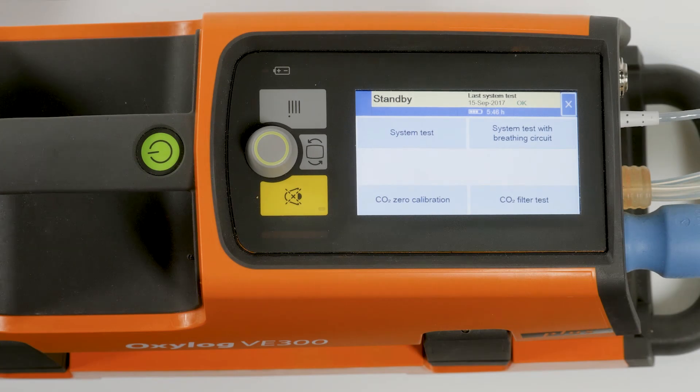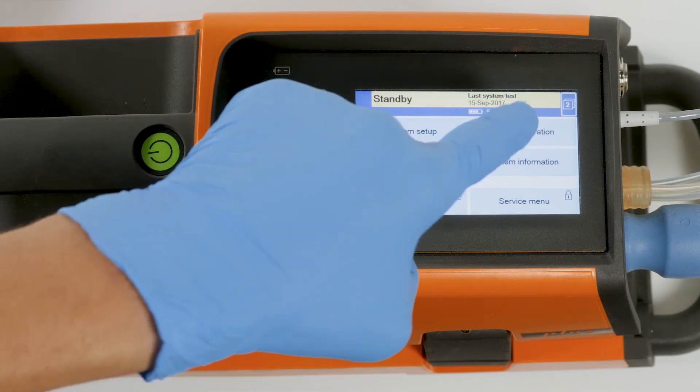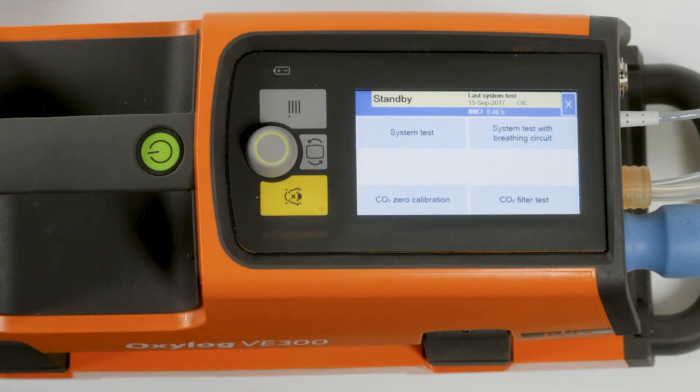The CO2 zero calibration and the CO2 filter test can be performed in standby mode and during ventilation. After connecting the CO2 sensor or after a power supply failure, the sensor must warm up for approximately three minutes before it is ready for operation. The CO2 zero calibration is carried out weekly. The CO2 filter test is carried out monthly. Touch the button test and calibration. As an example, we will show you how to perform the CO2 zero calibration.